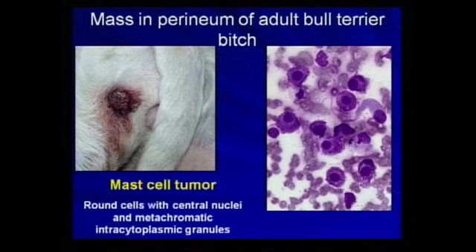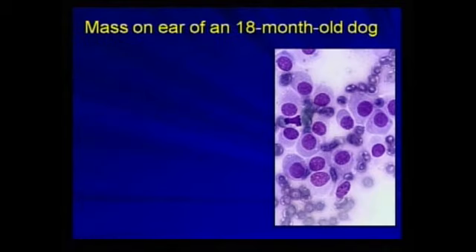Other cells that I see in here, of course, numerous erythrocytes, we have a neutrophil, and here's a spindle cell. This might be a fibroblast or maybe some granulation tissue around there. But when you see this many mast cells, we're not going to think, oh, there's a spindle cell tumor. Not with this many mast cells, and the gross appearance of a mast cell tumor.